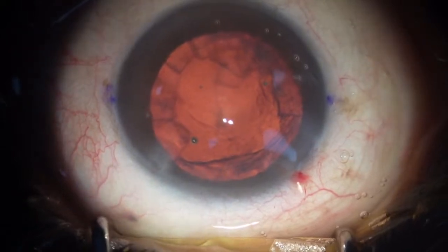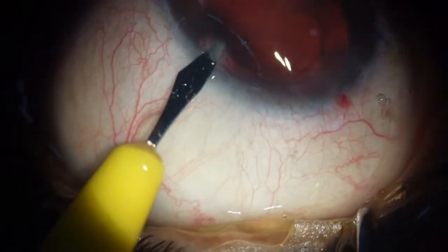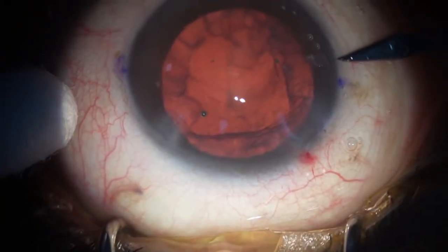So I'll have to, because my instruments are made to 22 and the side port was 23, I'm just enlarging my side port a little bit to allow my bimanual to go inside. I would normally use a 22 only.